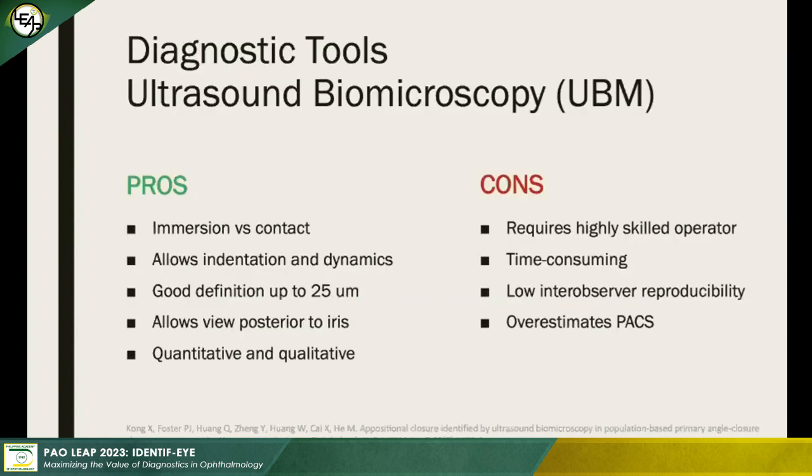You can also get the angle recess area. If linear values are not enough, there are certain computations that get area. Again, this shows us that the more robust the information, the more descriptive it gets.